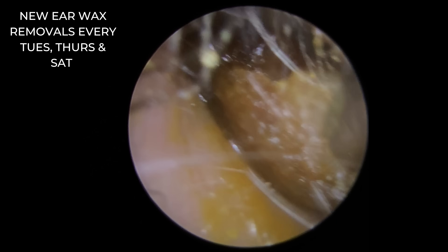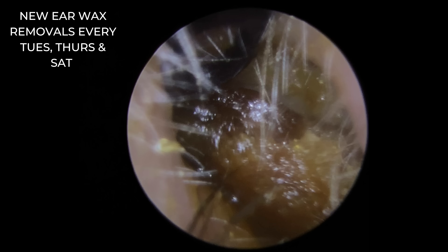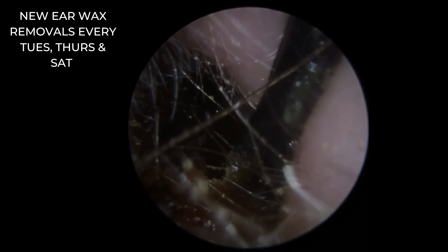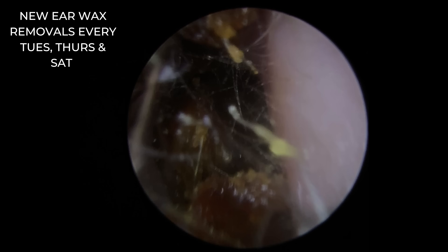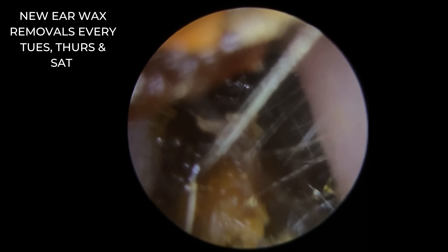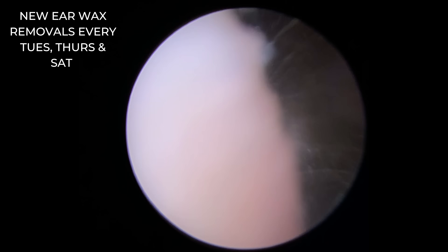What we will do — it's been a couple of days since I've done this one — I think we're going with the Jobson horn. Sometimes when you get these longer pieces like this, it's easier if you can get behind them to pull them forward with a Jobson horn. If not, sometimes it's easier to break the front section off the wax, take that out, and that gives you a little bit more room to manoeuvre with that slightly longer piece further in. This one hasn't broken away, so we're going to pull this next section of wax down. Out that comes.